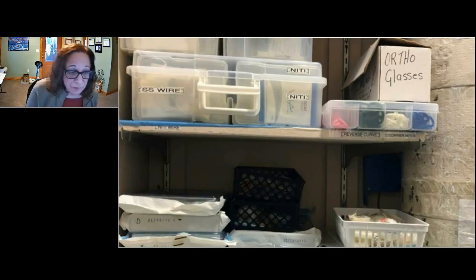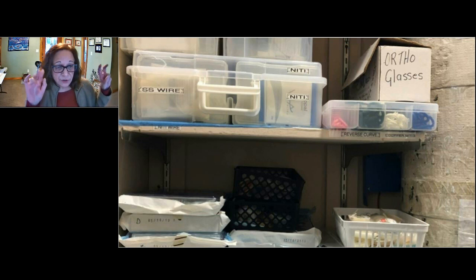Here are some more examples of sterile storage areas, in quotes, please. This was also something I saw. This was like a utility closet that someone stuck shelves in because they needed more space for storage of sterile instruments.